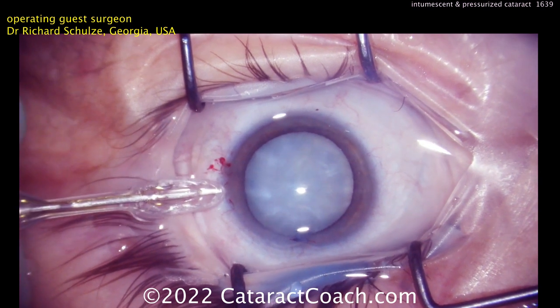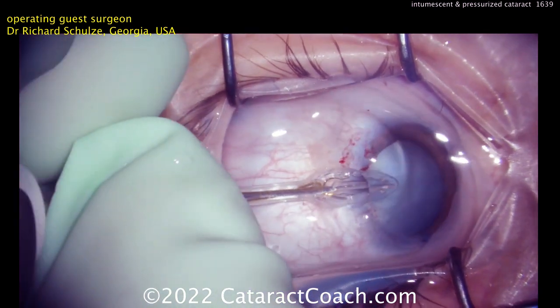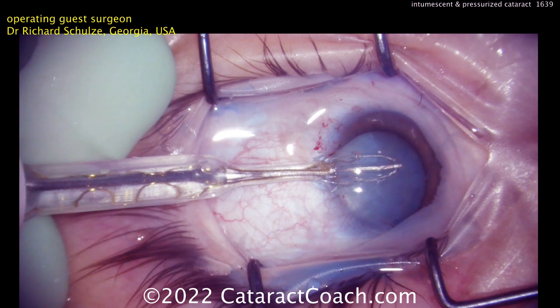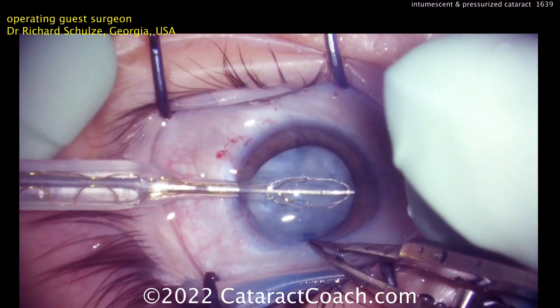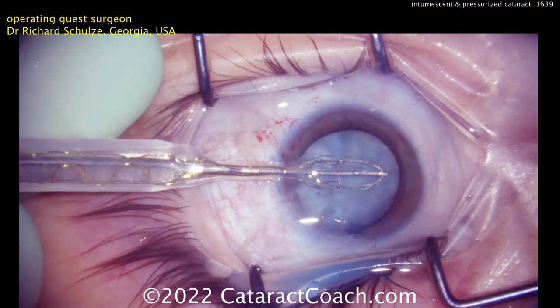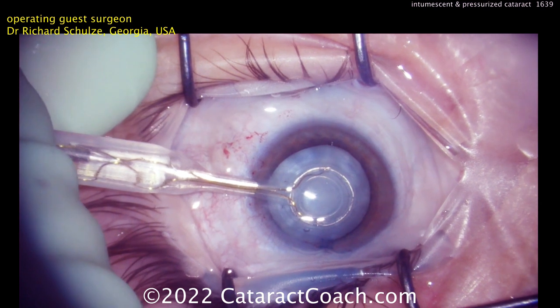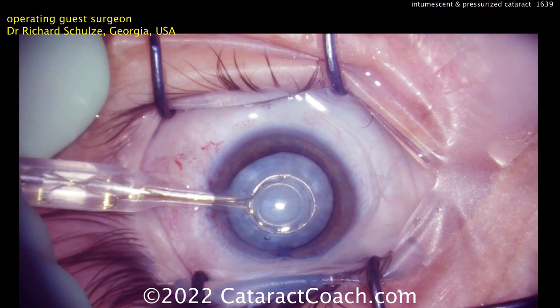The Zepto device is collapsed so it can go through a small incision — it has a nitinol ring on the tip. With the eye full of viscoelastic, you place it inside and can center the rhexis wherever you want. It goes through an incision of about 2.2 millimeters. You can fixate the eye and get it seated properly, then use the finger slider to open the nitinol ring back to its normal shape. This ring creates a capsulotomy about 5.2 millimeters in diameter. You center it using the Purkinje images.